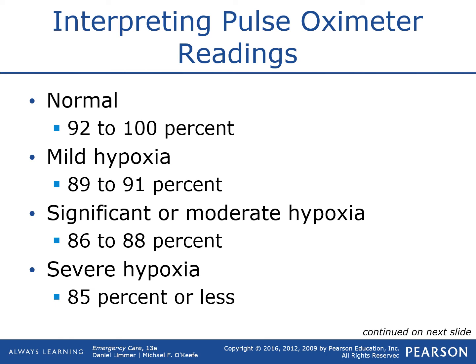So if you have a SpO2 of 85% or less, you're going to see someone with significant respiratory distress. You're going to see someone that has cyanosis, that's the blue color of the skin. You're going to see someone who is in significant distress somehow. I don't need my tool to give me an exact number to know this person is in distress. Yes, this tool helps give us an exact number so we can know how bad, per se, it is, but look at your patient first.